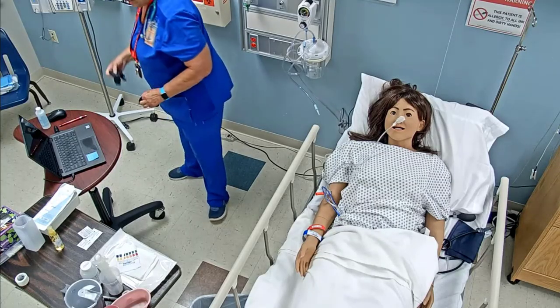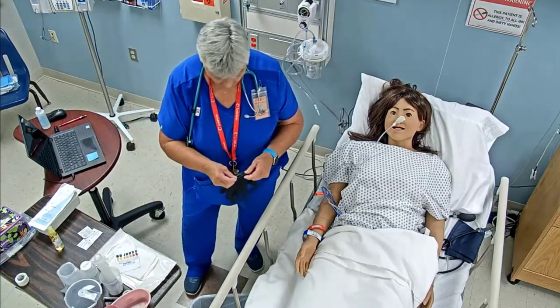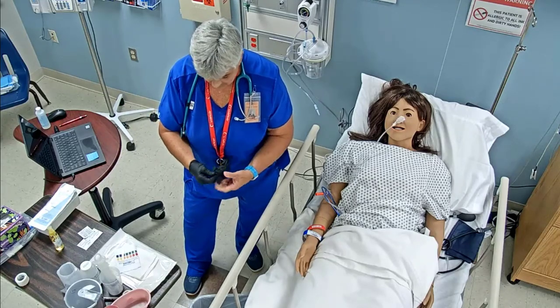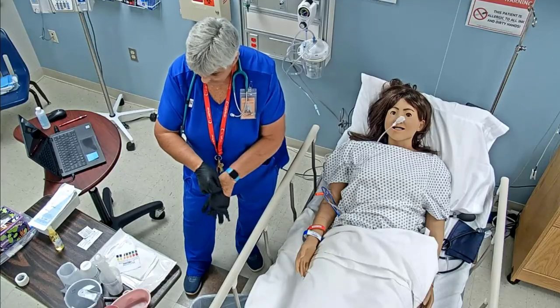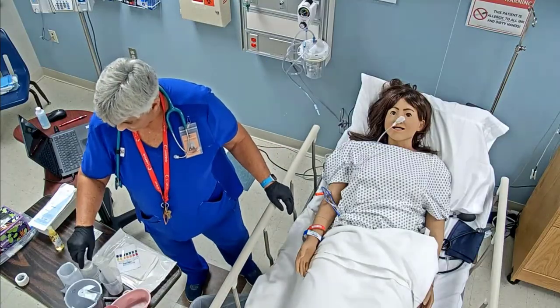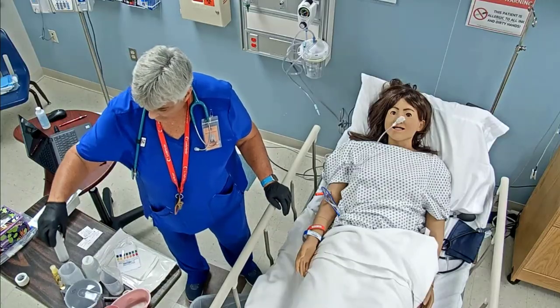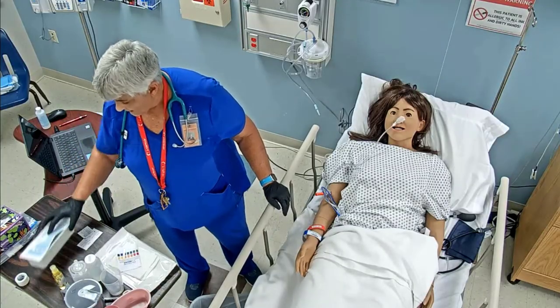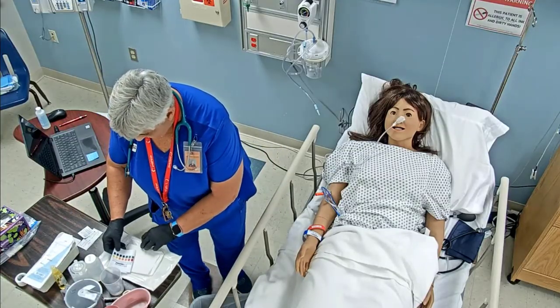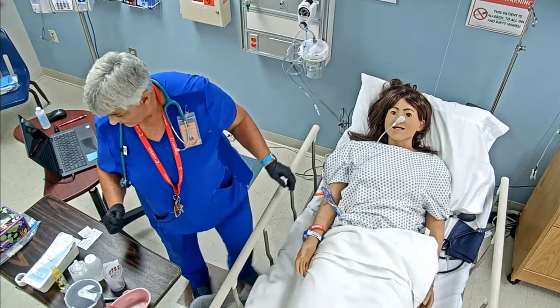We will probably be needing this as we go along, so all of that stuff will stay in here. We probably won't need that, but we'll leave that in here. So we're going to leave that in our cup here, and we're going to date, time, and initial everything that we used. We will need this at a later time, so I'm going to leave that in this cup right here, and just get rid of all of that right there.